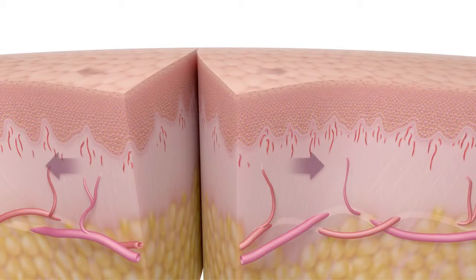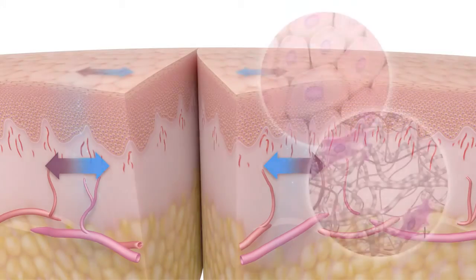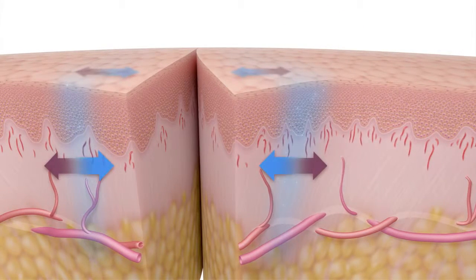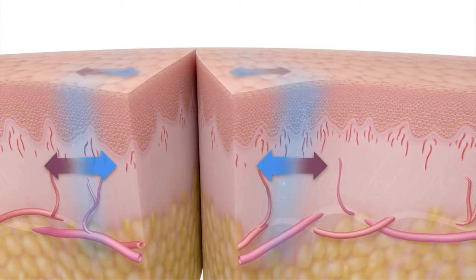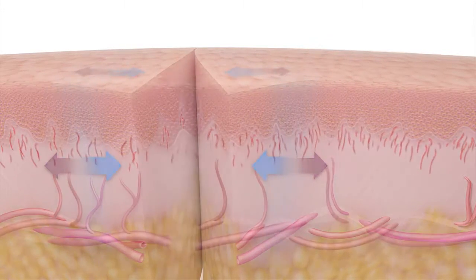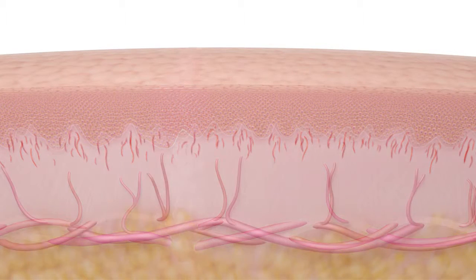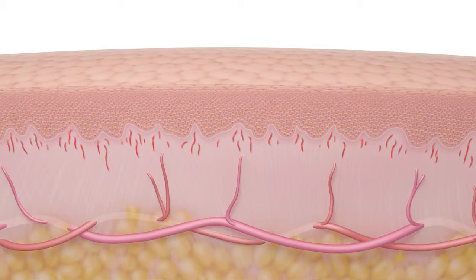However, skin can be returned to its original state when dynamic appositional forces are maintained in the early stages of healing. Cellular structures return to their normal tension configuration, and granulation is reduced. This prevents the skin edges from becoming fixed and promotes fast healing. When additional tension is introduced, further biomechanical processes come into play.